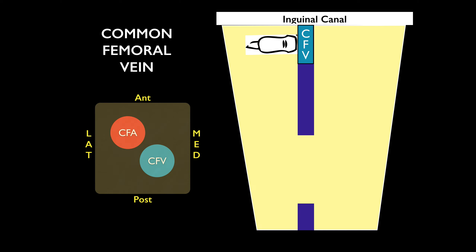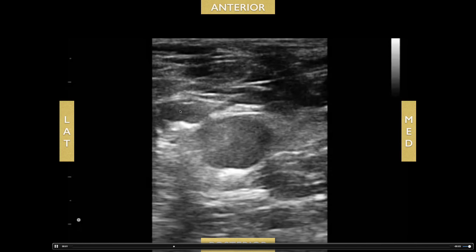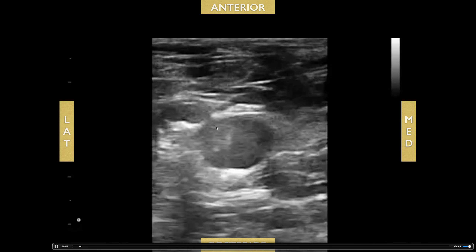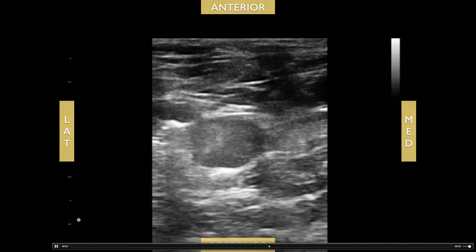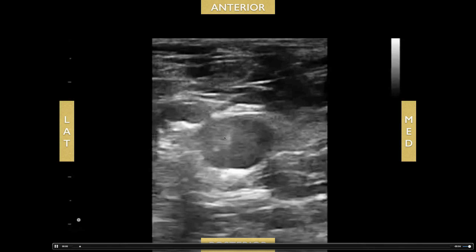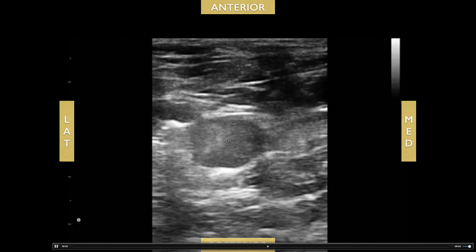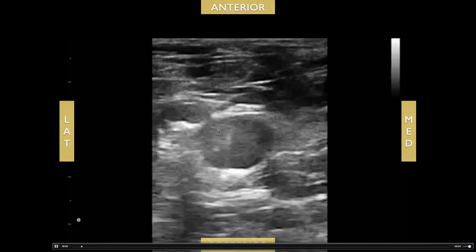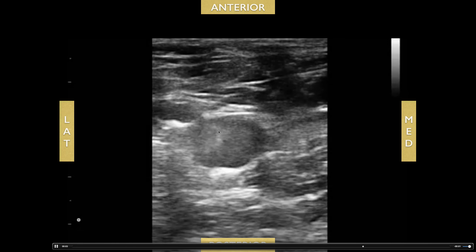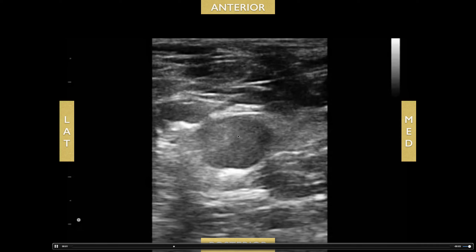Here are some abnormal scans. Looking at the common femoral vein first: you can see the common femoral artery here and the common femoral vein, and there's actually a clot inside the common femoral vein just loosely hanging out. If you try to do augmentation, that increased blood flow might dislodge the clot and cause a pulmonary embolism — so augmentation is not recommended in this patient. If you see a clot, that's sufficient. Don't compress too hard either, as that might also dislodge the clot.